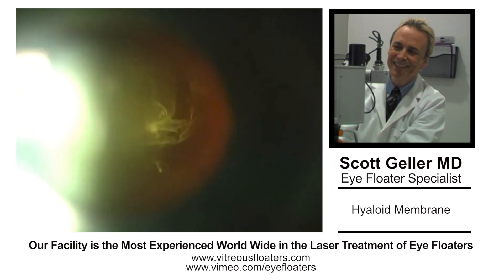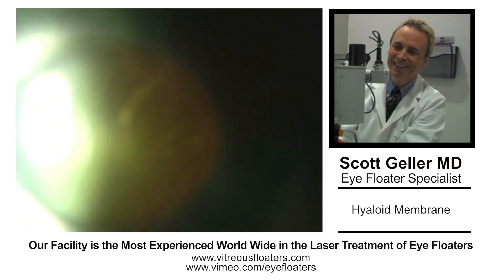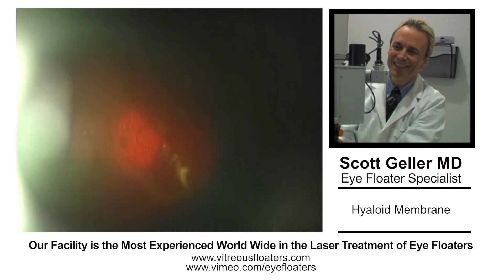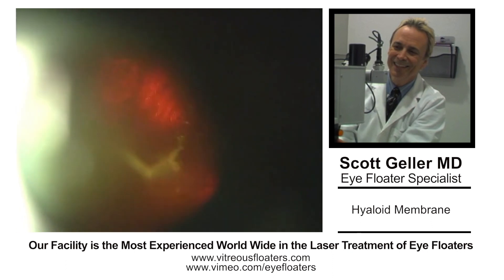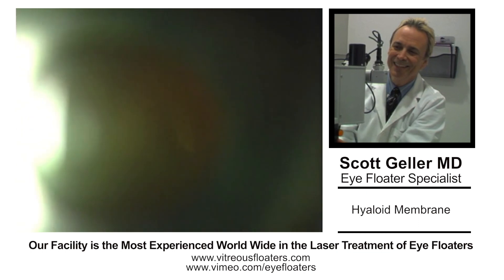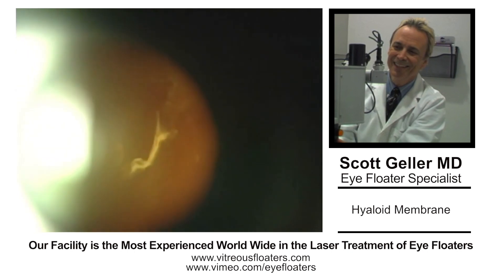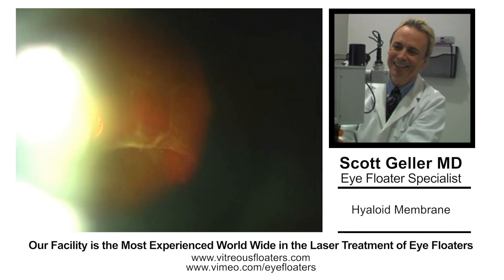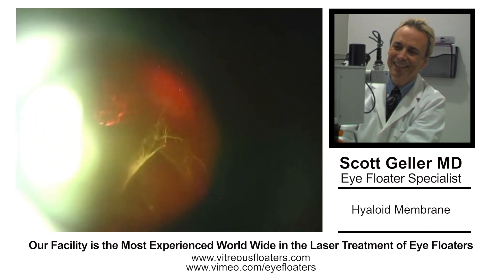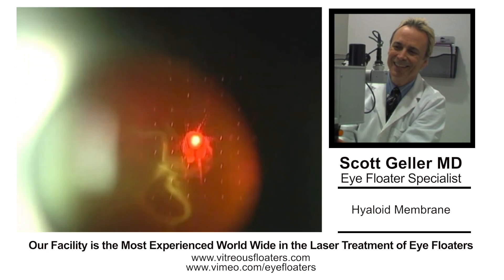Any ophthalmologist who says this can easily be done in one session really doesn't have a good handle on it. There are many colleagues who are a bit inexperienced because there are no good training facilities available for this. I went to Switzerland, learned the technique there on diabetic membranes, and brought it back to the United States — we were the first facility to start doing this on a continuous clinical basis. We're continuing to cut the vitreous membrane here. The goal is to create a nice window and ultimately clean up all the debris. There will be a lot of debris from a case like this, which is the main reason you need at least 4 laser sessions. There's a limit to the amount of energy you want to put in for safety purposes, as complications can arise from too much energy in one session.